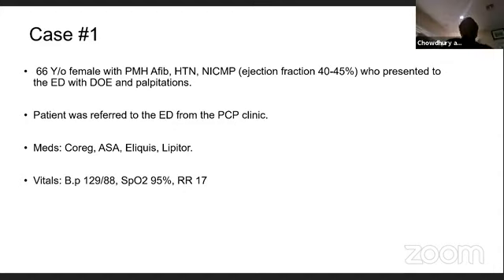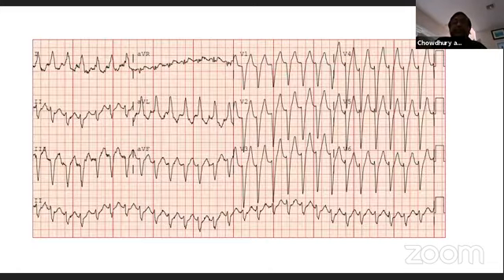This is the history. Non-ischemic cardiomyopathy, diagnosed with cardiac cath 3 weeks ago in another facility, came into our hospital. History of quote unquote AFib. They started on apixaban. This EKG, but in the ER, they gave adenosine, and this happened. I'm so sorry about this poor tracing, but you can probably see that the adenosine did break the tachycardia.